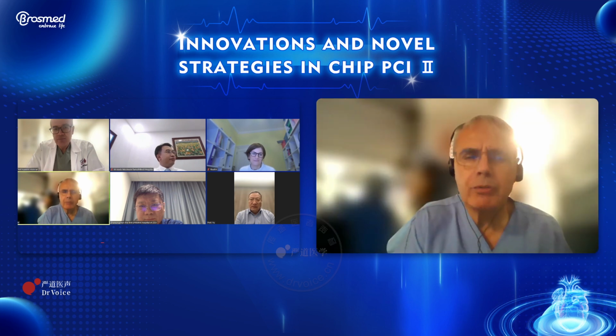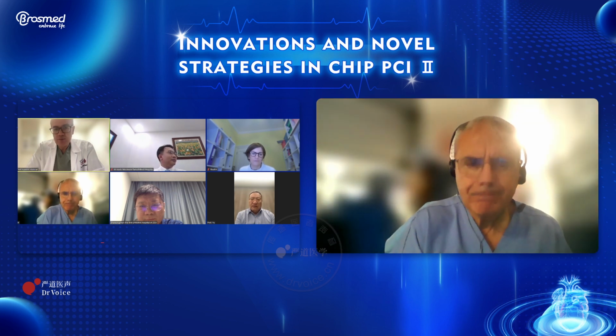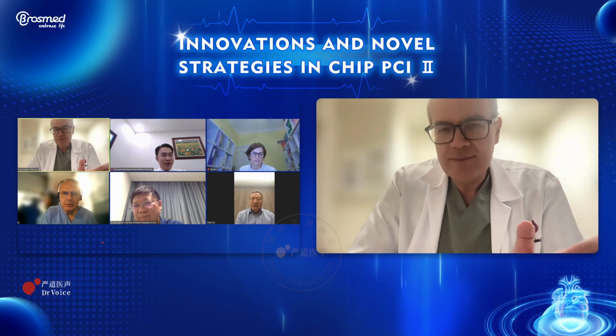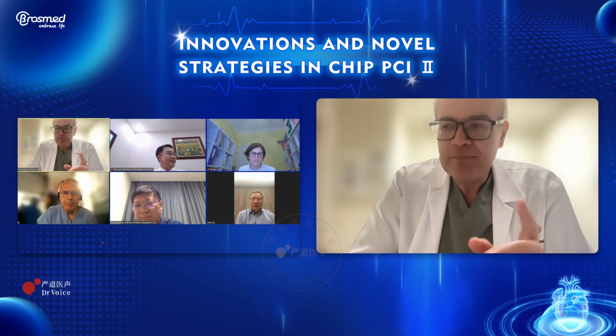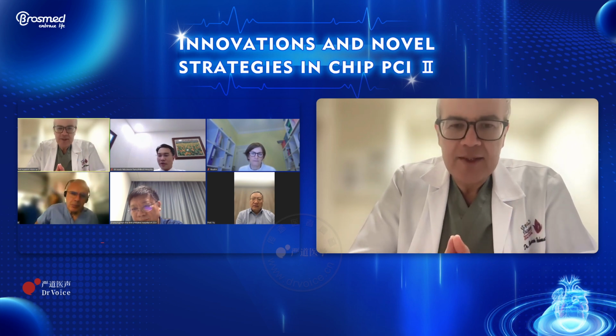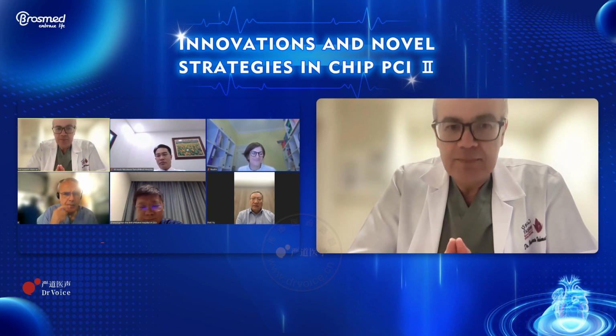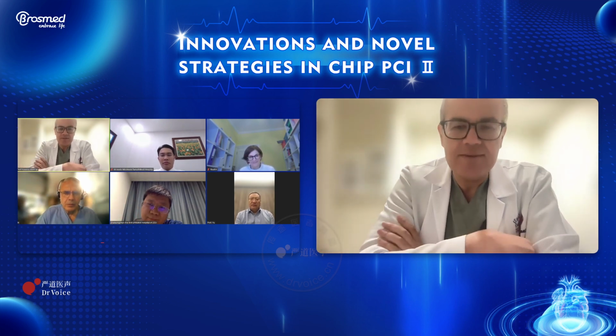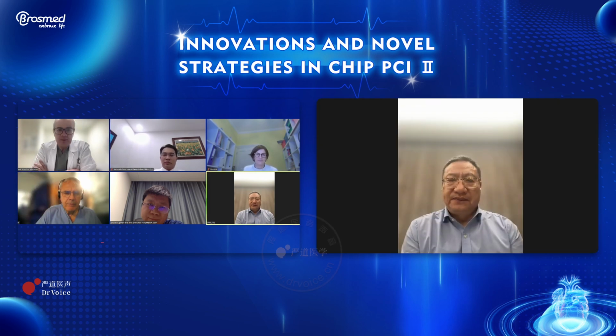Absolutely agree. Absolutely, my experience too. With stent thrombosis every 6 months or 1 year, even when we use imaging, even when we use OCT, I'm ready to tolerate DCBs rather than drug-eluting stents. And the theory of plaque sealing by angioplasty is by Bernhard Meier, one of the pioneers of angioplasty since the 1970s and 1980s. Good, thank you.